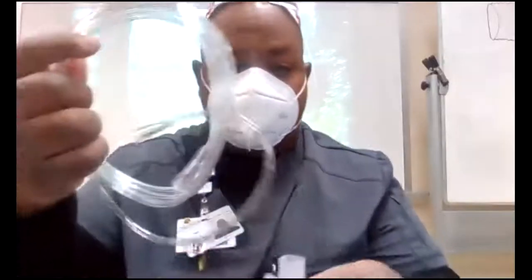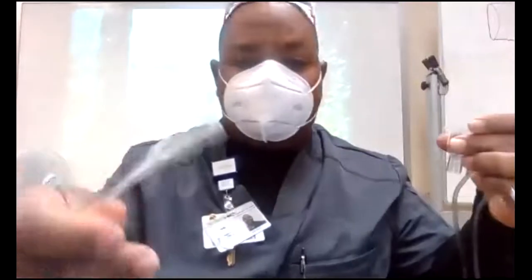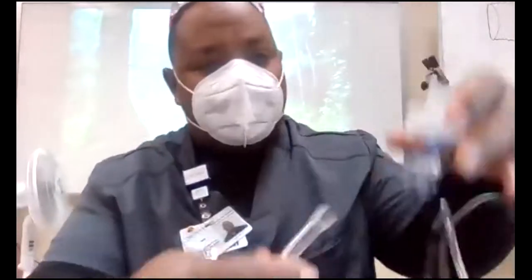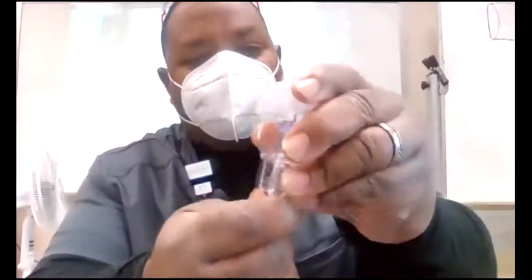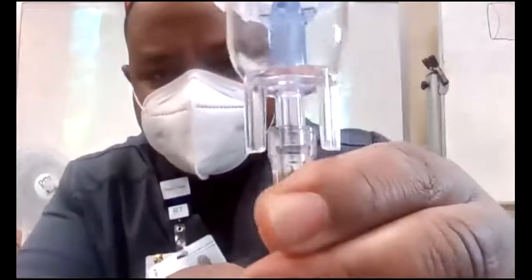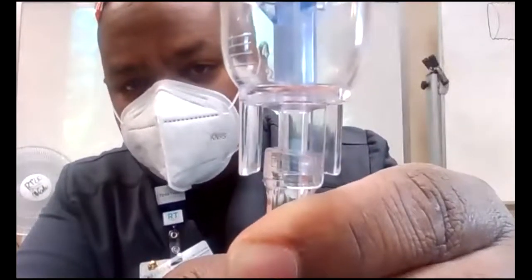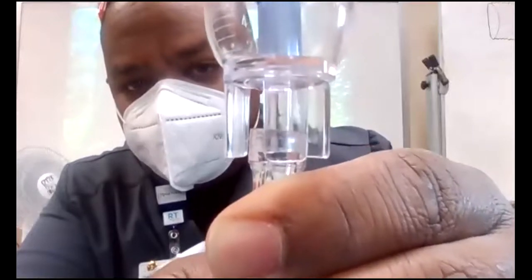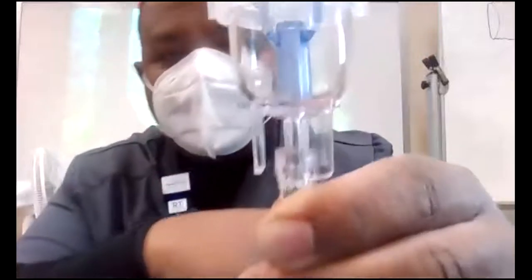Then you have small bore tubing, just a regular female on both ends. Small bore tubing. It goes on the bottom of my breathing treatment or my small volume nebulizer. Notice how many cc's. Can you see the cc's on here? How many is that? I can see four. See the four? Okay, so four, probably about six in this one, right? It's a small volume nebulizer because it's less than how many?